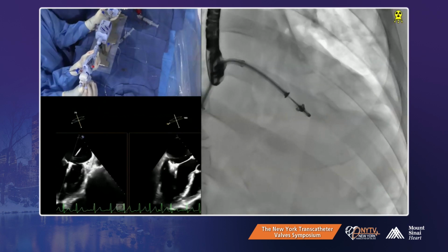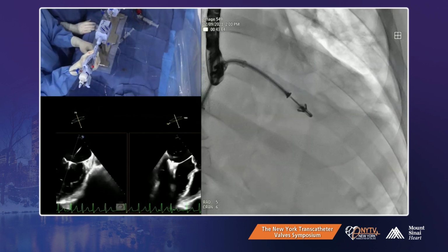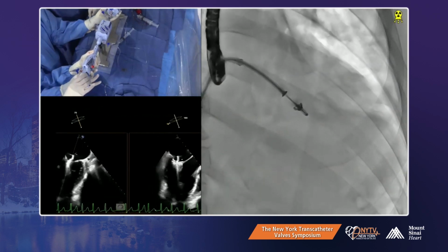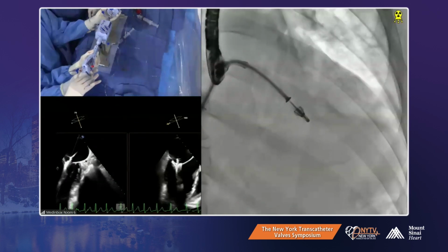Okay, now they're in. Okay, drop. Come off the anterior. We dropped it. Oh, okay. Yeah, that's bounce. Okay, that's good. Let's close there now. Yeah, we're closing. Stay in this view, please. That looks like you got it. We're close to 60.